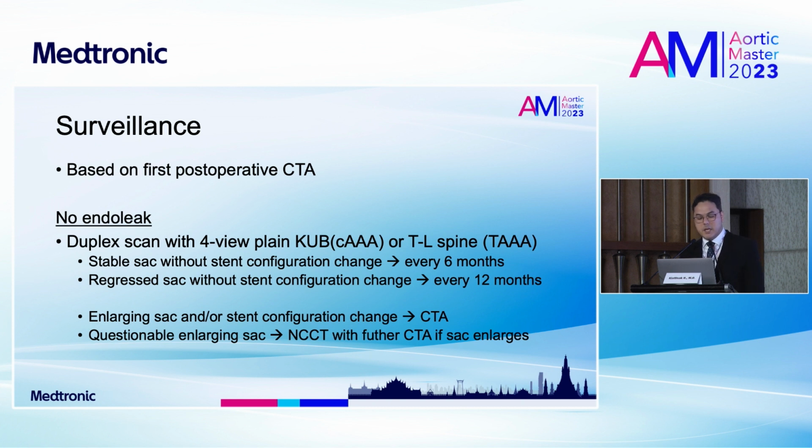Whenever the patient has an enlarging sac, or even with a questionable sac enlargement or not, we start with the non-contrast CT first. If we confirm the sac size, and then we can follow with the contrast CT if enlarged.